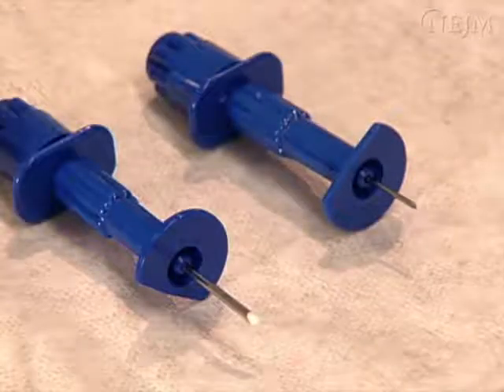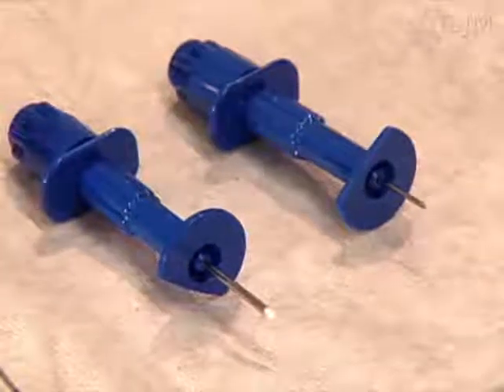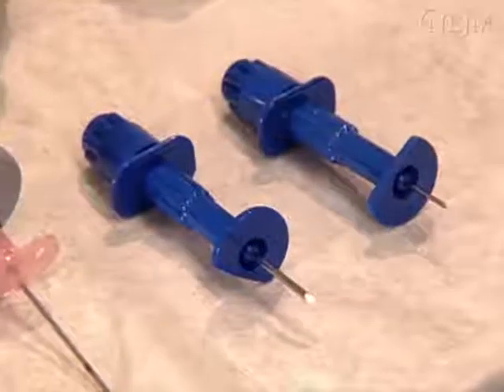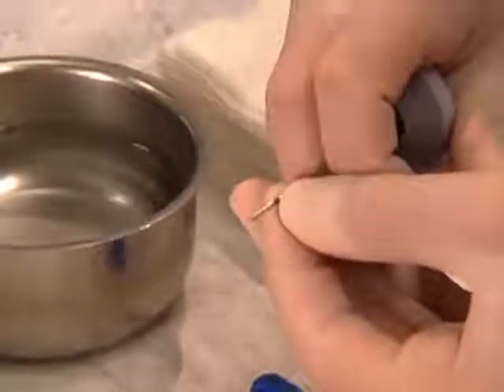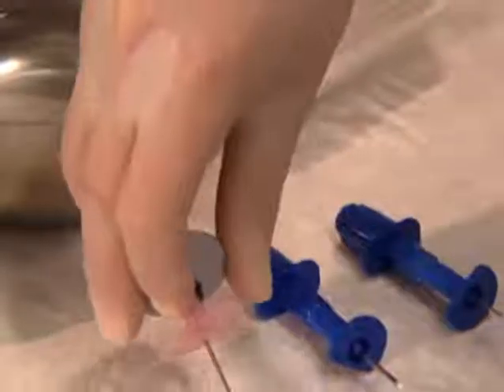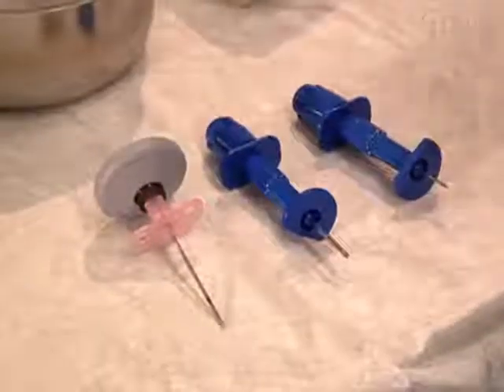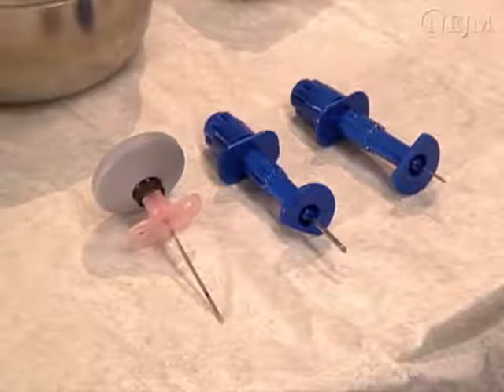Manual needles designed specifically for intraosseous access are available for use in children of all ages. These needles have cutting stylets to prevent soft tissue or bony spicules from obstructing the cannula, ergonomic handles to facilitate placement, and depth markings or an adjustable flange to guide depth of insertion. Large bore spinal and butterfly needles may be used in infants if an intraosseous needle is not available.